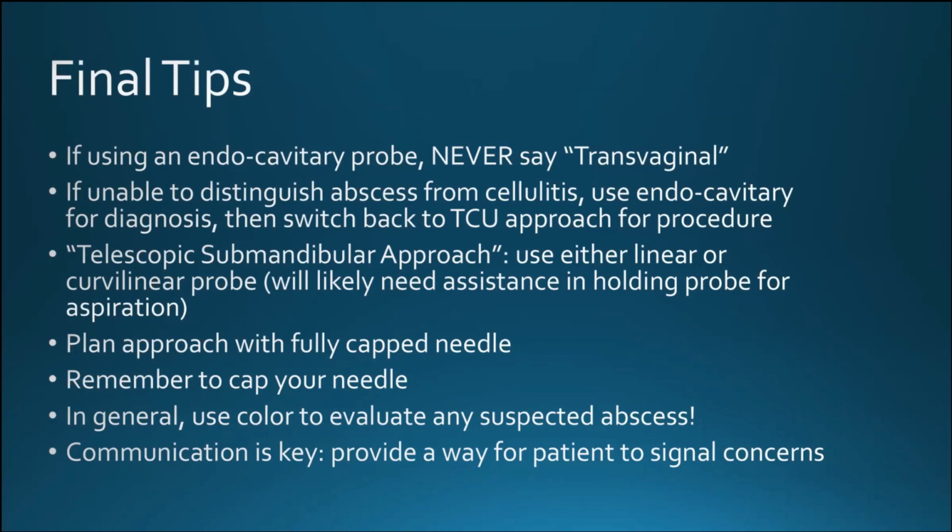And then again, regarding the vascular structures, make sure to plan the approach with that fully capped needle because of the safety of that in terms of the vascular structures. And then again, you're going into the mouth with a needle. Patients can be cooperative, or they can sometimes syncopize on you, or have a knee-jerk reaction and end up moving their head one way or the other, and you don't want the needle accidentally going into areas it shouldn't. And then in general, just regarding any abscess you see, always use color, just in case there might be a pseudoaneurysm in that area.